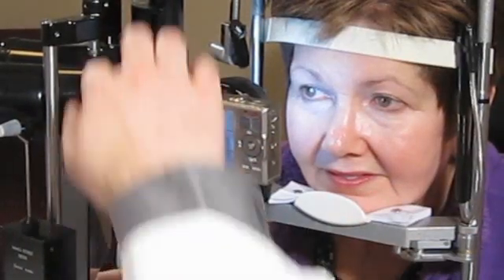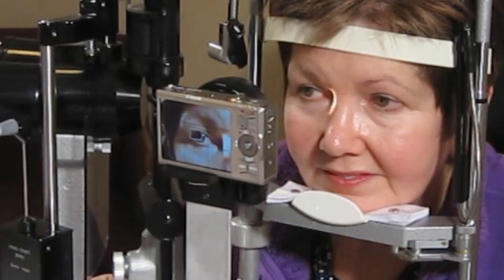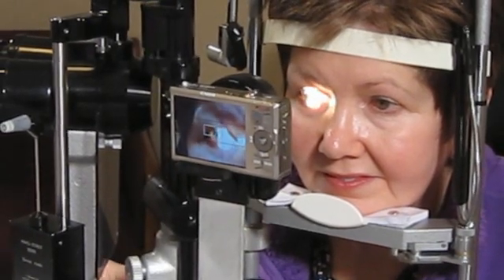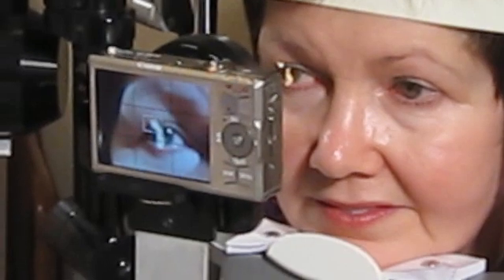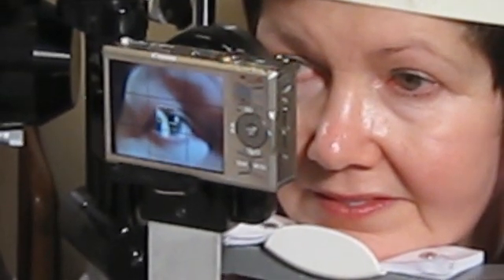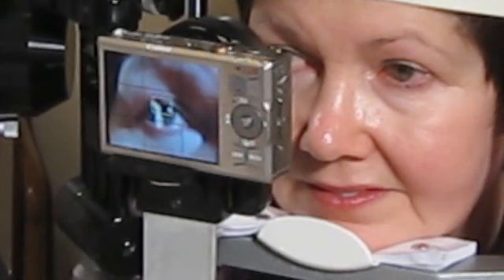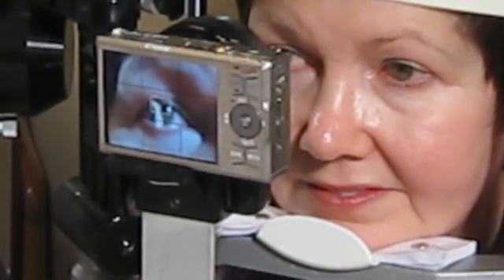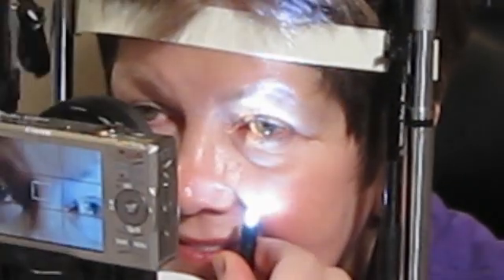Corneal or anterior segment pathology can be imaged with the slit beam alone or supplemented with the ring light. The support arm is adjusted to bring the slit beam into the picture. In some situations, a single LED light on a flexible arm will provide the best illumination or may be used to supplement the slit beam.